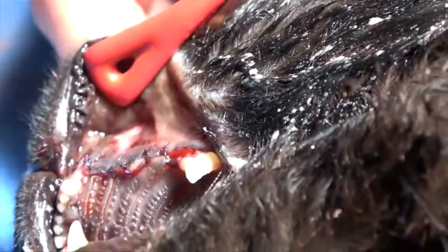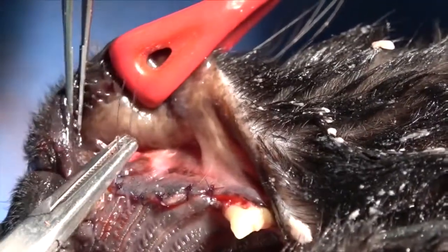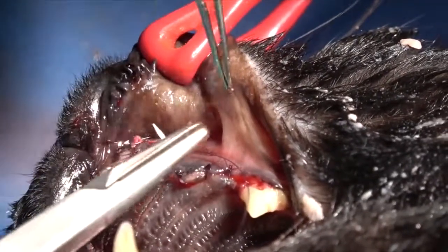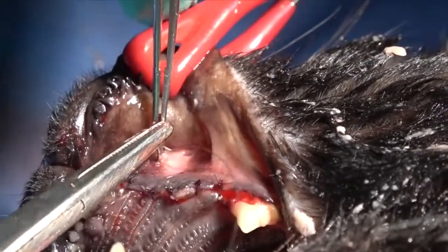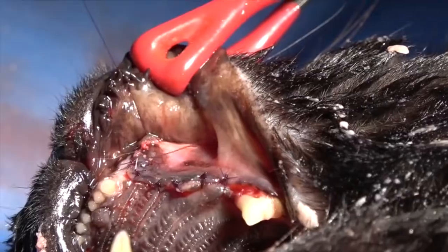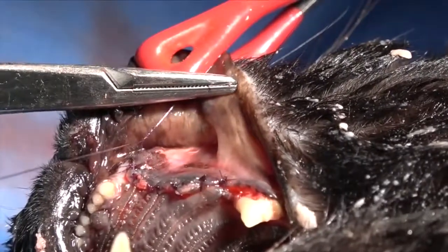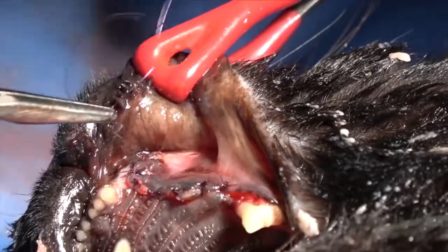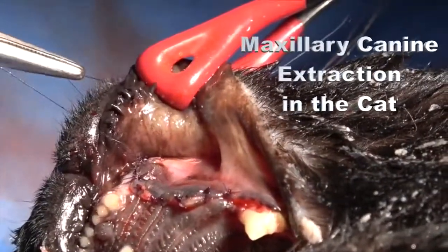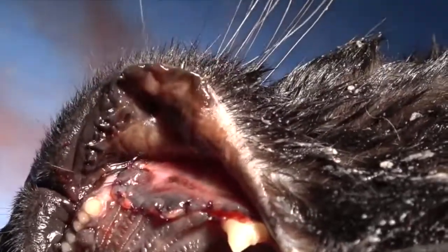With the help of a retractor, an assistant, or both, we'll place this last suture. Watch carefully — this is a figure-8. We just make one pass, then come back apical to that and make another pass, then tie it. There's no tension there; it's all unattached gingiva, so we can do that little figure-8, which is much quicker and more efficient than putting two simple interrupted sutures there. Surgeon's knot and two simple knots — and that completes the maxillary canine extraction in the cat. In this case we had a little variation with vestibular bone expansion.